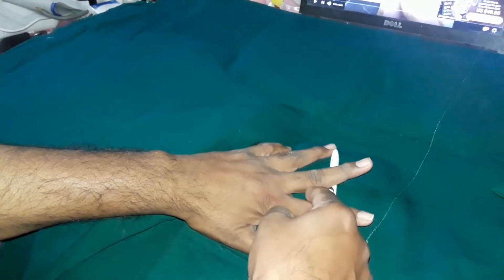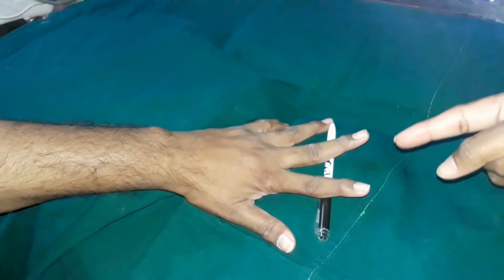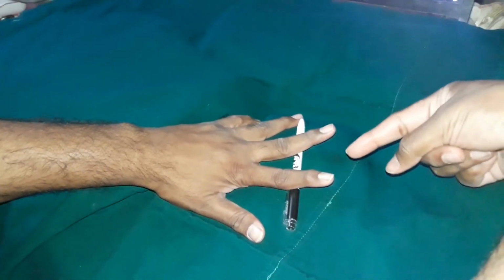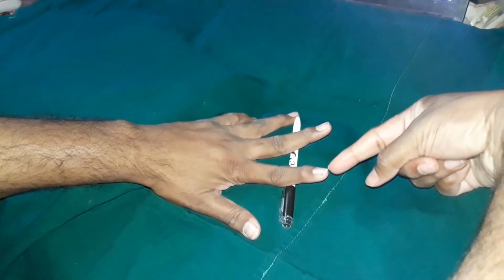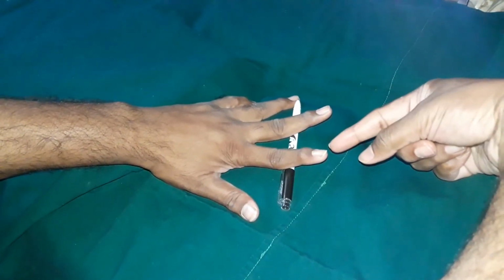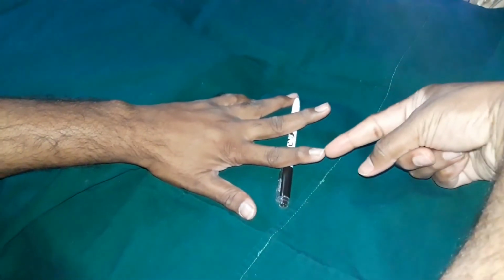So when you are drilling caudally, there is a higher chance of injuring the facial nerve here. And this is my right hand index finger. This is the short process of the incus. This always points to the second genu. So the point is, this short process of the incus is in line with the vertical part of the facial nerve.